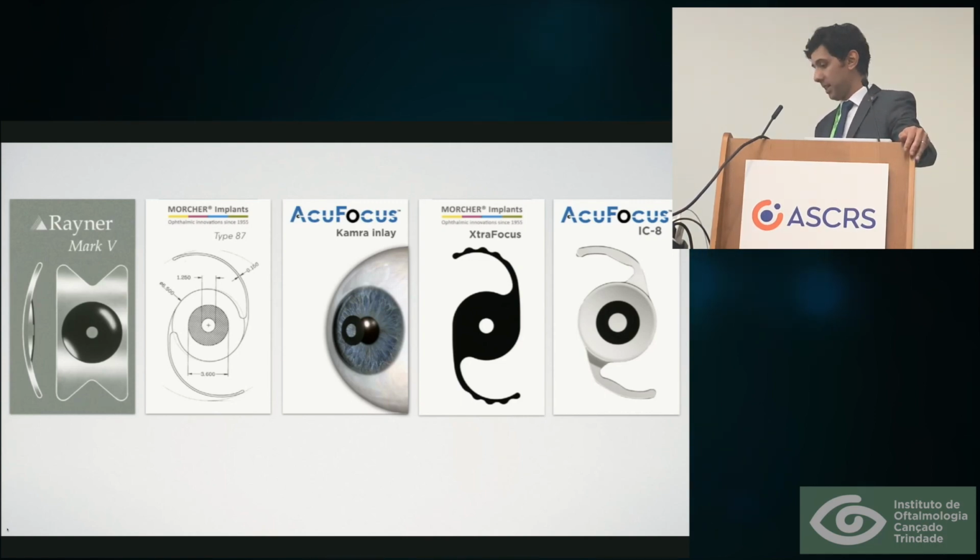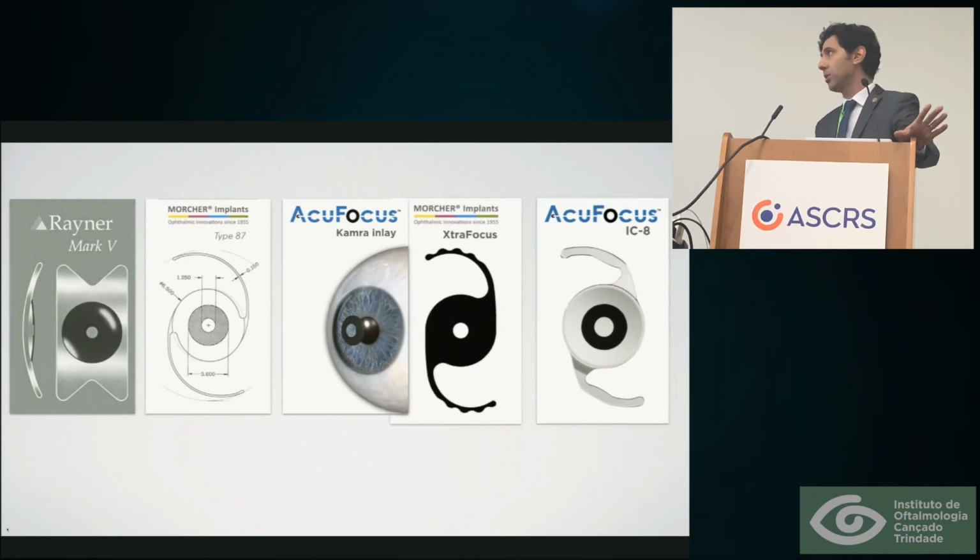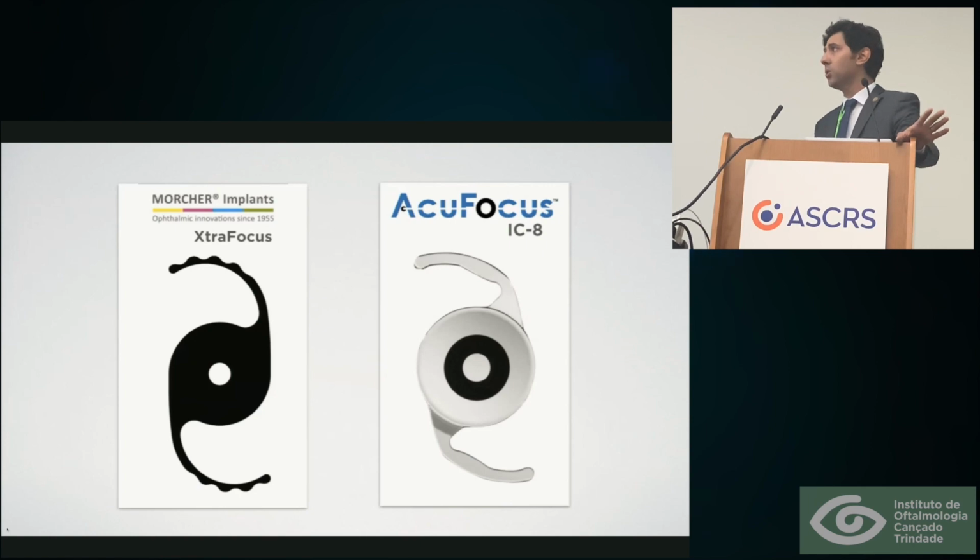But we witnessed a transition to a direction of a posterior chamber IOL, with the pinhole principle closer to the iris plane. That's what the current trend shows. And these are the current 2 implants that use this principle, and they have some differences.